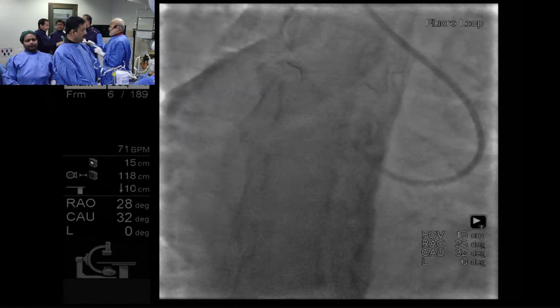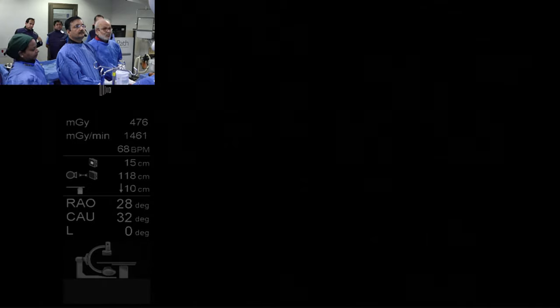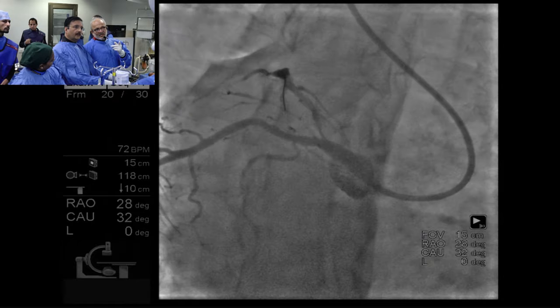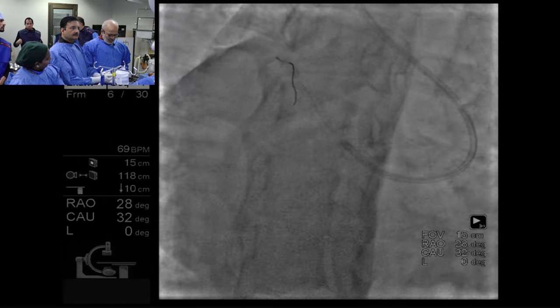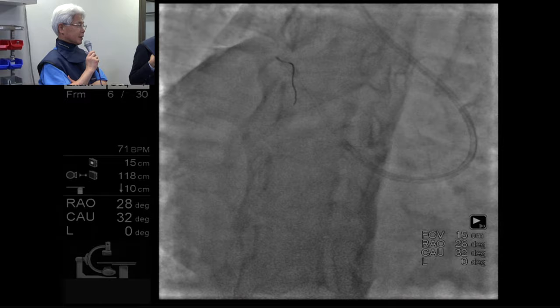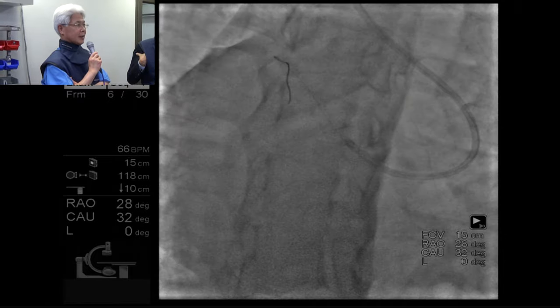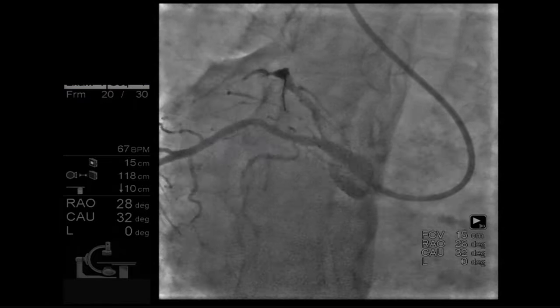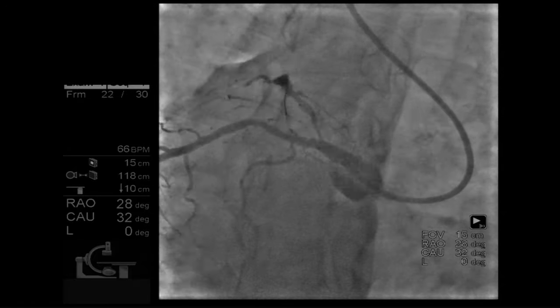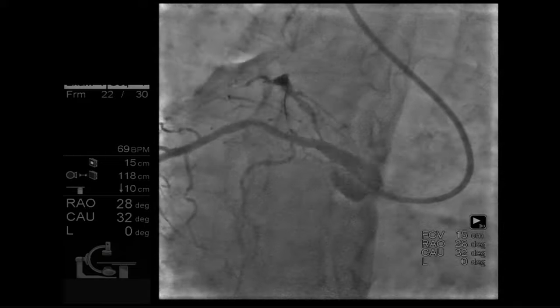Professor Akasaka, would you have any comment on this? The thickness of calcium is very important. Now we can use OCT to choose which type of PCI, a bigger balloon. If the calcium is less than 500 micron, we can make a crack or a dissection with high pressure ballooning or a cutting balloon. So 500 micron is one of the cutoff points to decide the treatment. Yes, I think that's a very good suggestion.